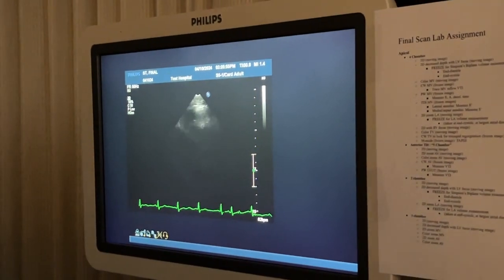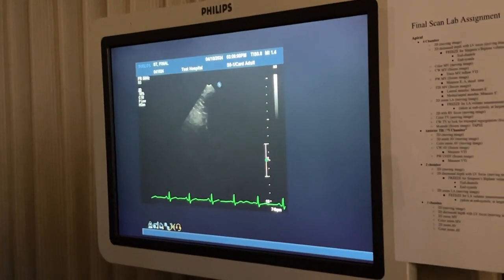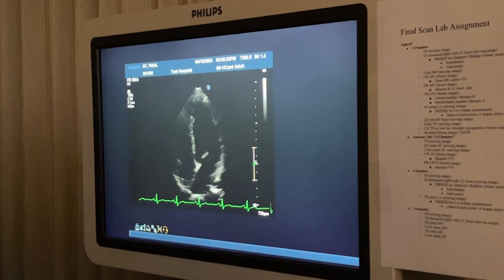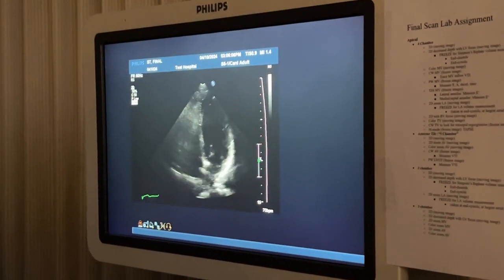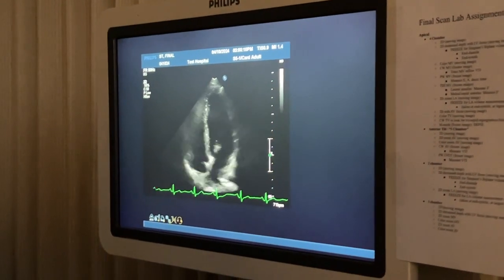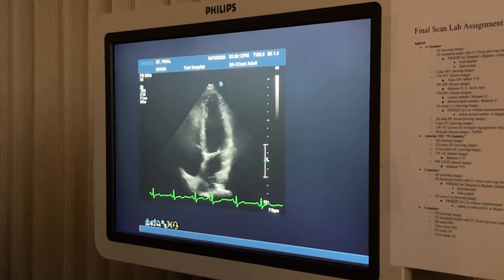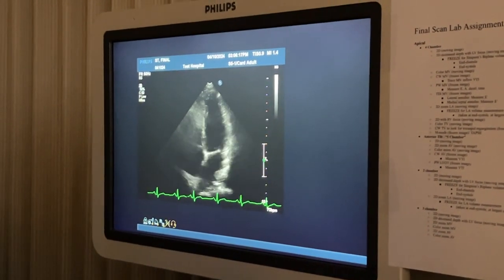Let's see, where's the apical? No, I know you have a really beautiful one. I haven't scanned you, I don't think. Not really. Oh my gosh. I get so jealous. I don't know, this could be hard. I know. I get so jealous. I'm like, damn. I'm gonna scan you. Perfect. Two seconds later, there it is. I'm like 20 minutes later.